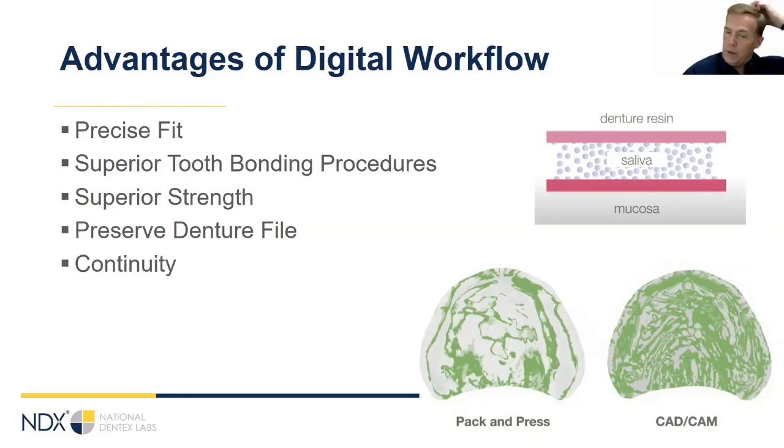Digital dentures, some of them are made as one piece. And so obviously the teeth aren't going to delaminate because it's all one piece. But even for the ones that have the teeth and the denture base separate, there's never been any wax involved. And the way that they're placed in the denture base is similar to how you guys do direct composites.